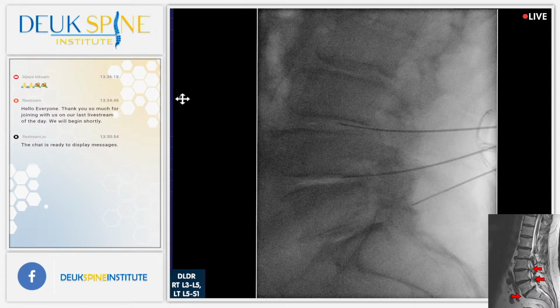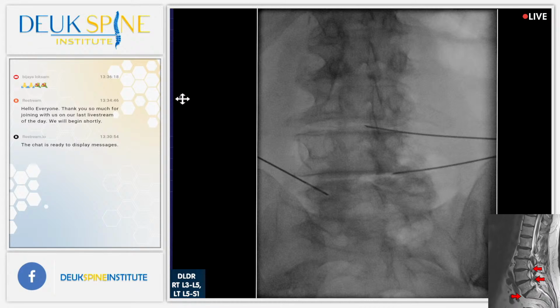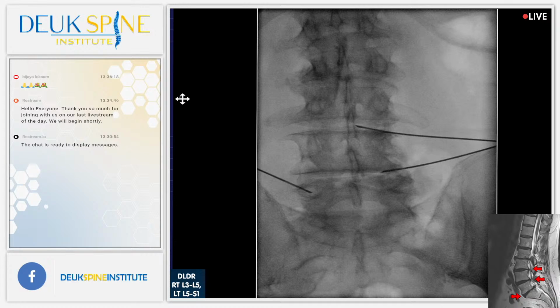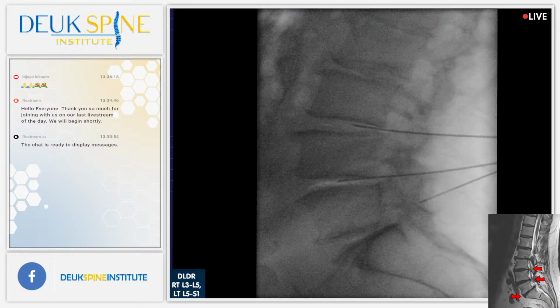I'm going to use an X-ray machine, with front, back, and side-to-side views, to guide the surgery. I need you to, yeah, that's better. All right, back to a lateral view. You can see the L3-4 and L4-5 needles; the L4-5 is just hitting the bottom of that L4 bone. I'm going to have to wiggle it a little. That's it. That worked. We're in at 4-5 now. Just got to work on 5-1.